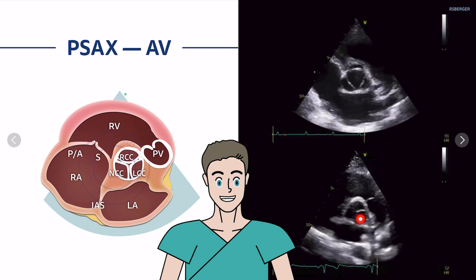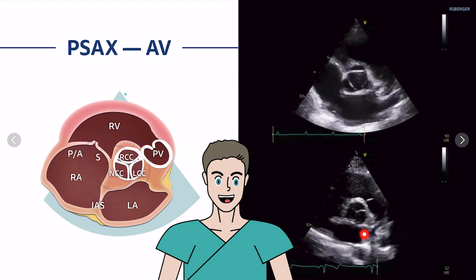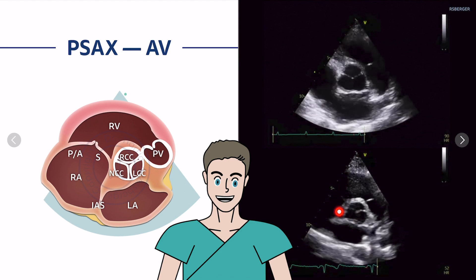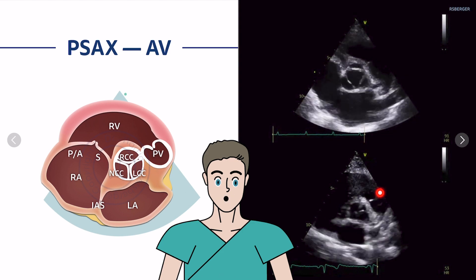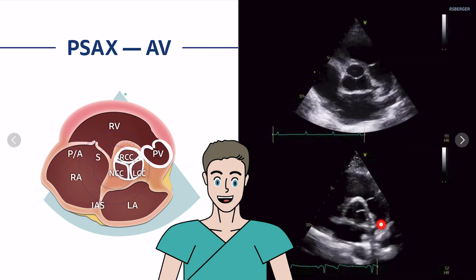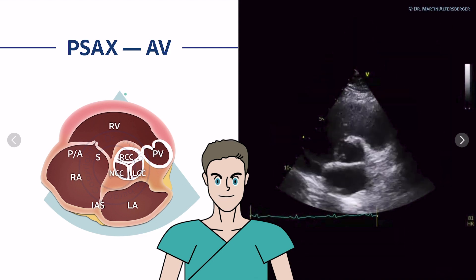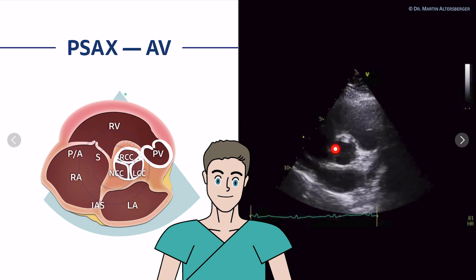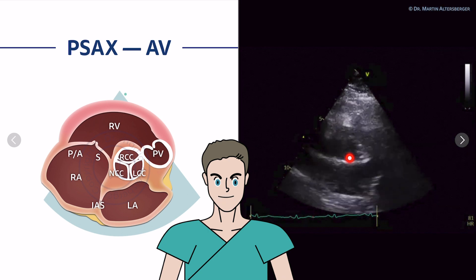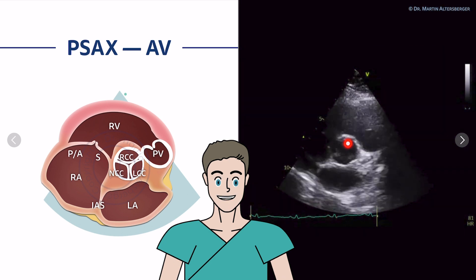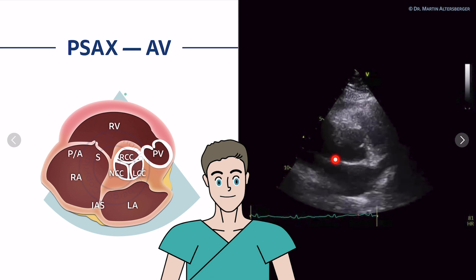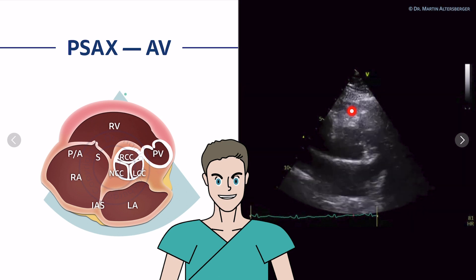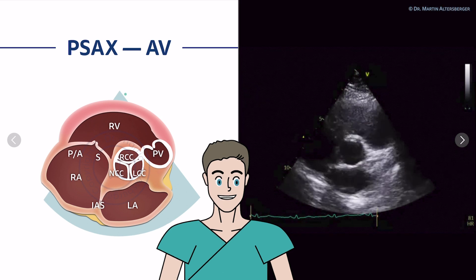In this view, we have the same anatomical findings: the right coronary cusp, the left, and the non-coronary cusp. When image quality is not optimal, you can often still differentiate a tricuspid aortic valve, seen as a Mercedes star pattern — this is the right, the left, and the non-coronary cusp. Also visible here are the left atrium, right atrium, RVOT, and the left atrial appendage.